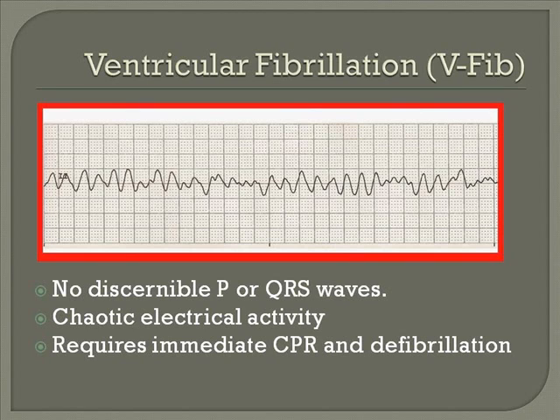This needs immediate CPR and defibrillation. If you have an AED, hopefully it would identify this and shock this person right away. The longer you wait to shock them or to begin CPR, the lower their survival rate is. Every minute that they are not defibrillated, their survival chances go down significantly.